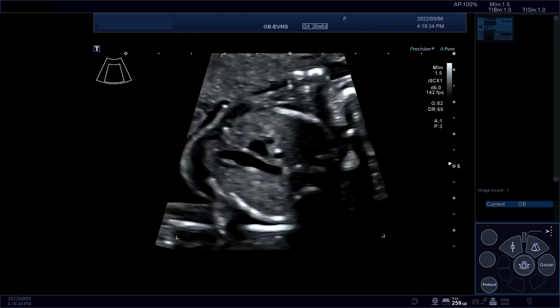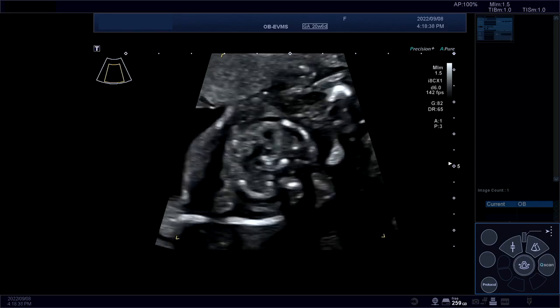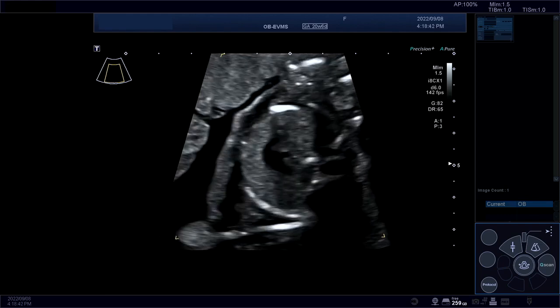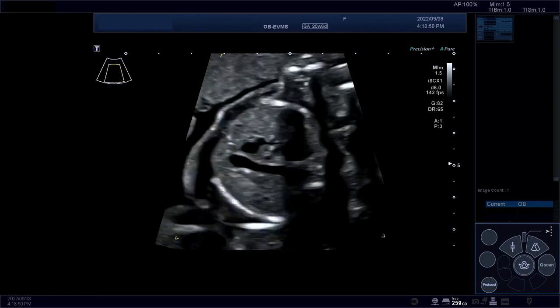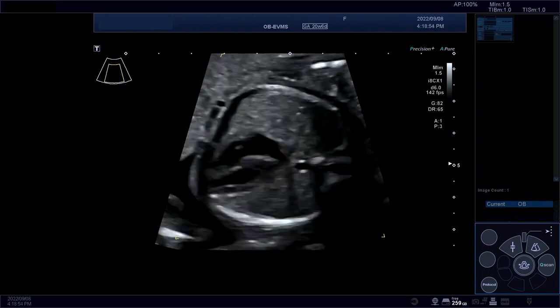And if you keep sliding up from this view, you get the brachiocephalic vein. So I'm going to turn a little bit to highlight the brachiocephalic vein, and this is your brachiocephalic vein here at the border of the thymus gland. Now I'm going to show you color for all these applications. So we're going to keep this in the middle.